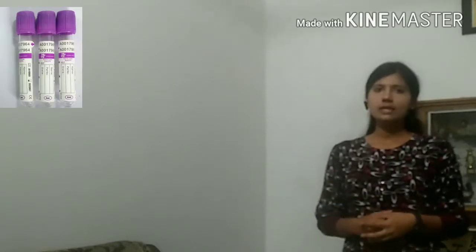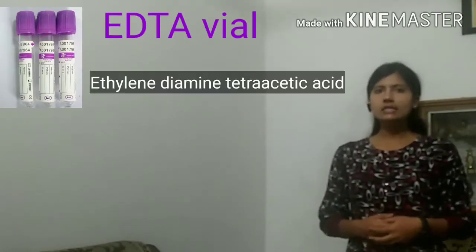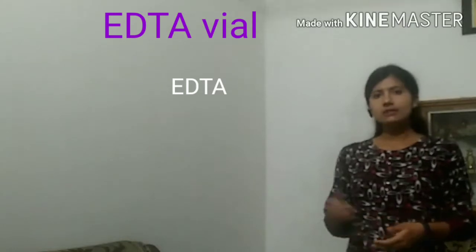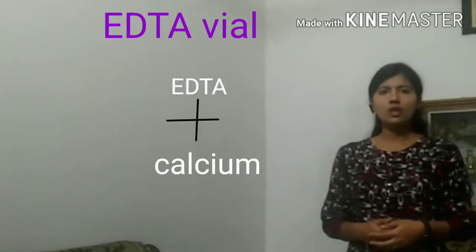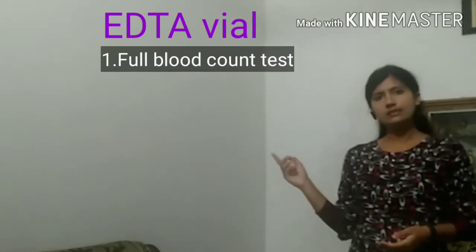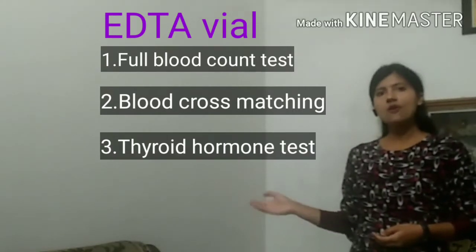Third, purple vial. It is also known as EDTA vial as it contains ethylenediaminetetraacetic acid as an additive. EDTA is an anticoagulant. It binds to calcium and doesn't allow blood to clot. Some common tests using purple vial. First, full blood count test. Second, blood cross matching. Third, thyroid hormone test.